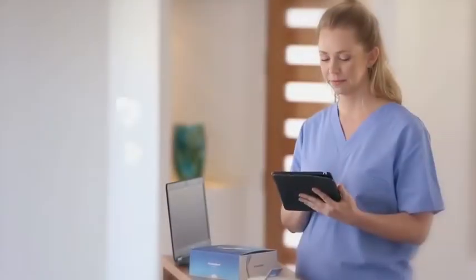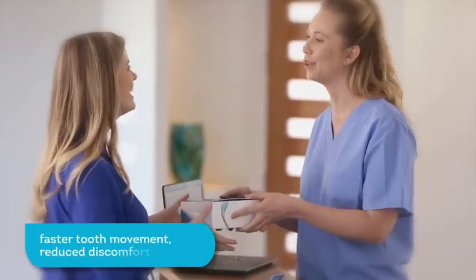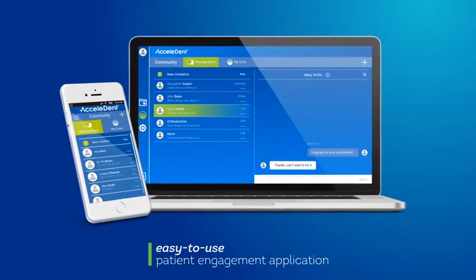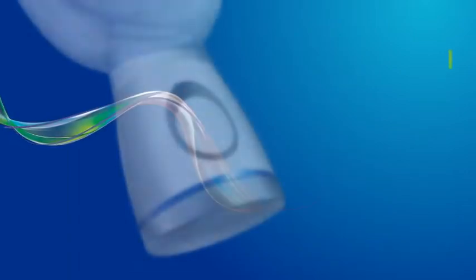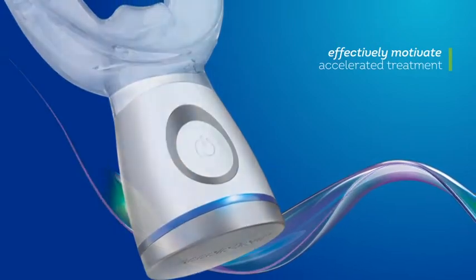Added to treatment, Accelident Optima improves the orthodontic experience with faster tooth movement, reduced discomfort, and an easy-to-use patient engagement application. The Accelident app utilizes well-known behavioral science techniques to effectively motivate positive behavior and transform your accelerated treatment.